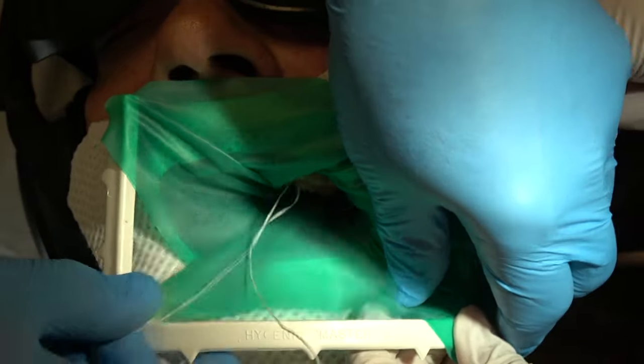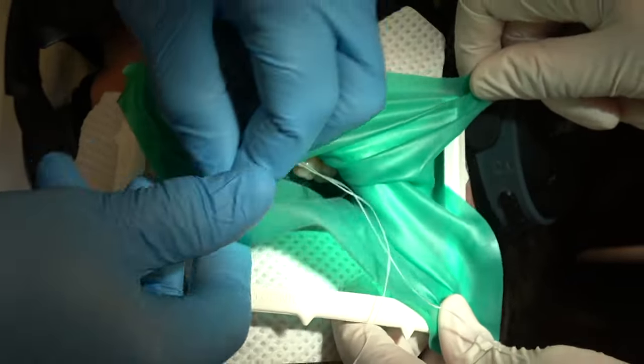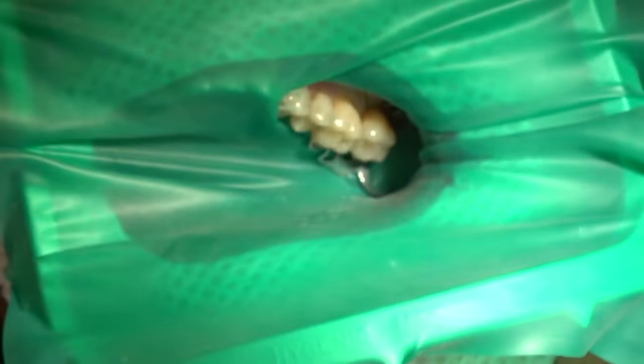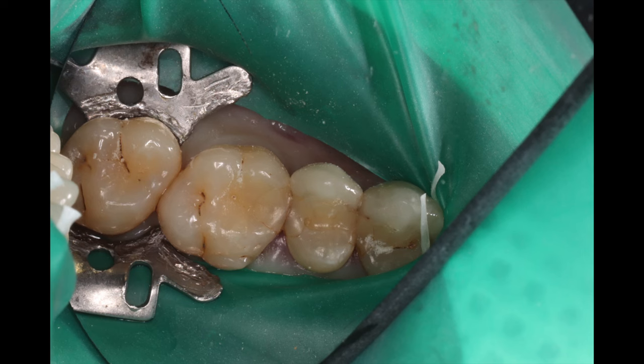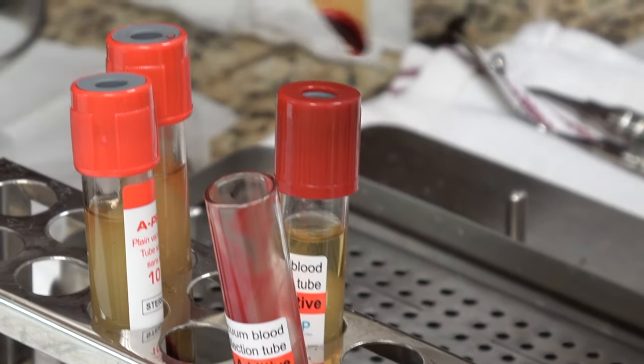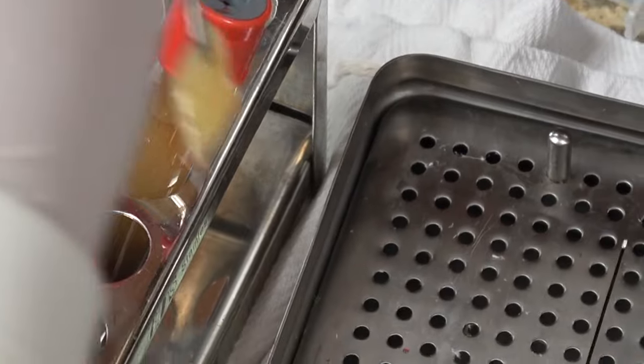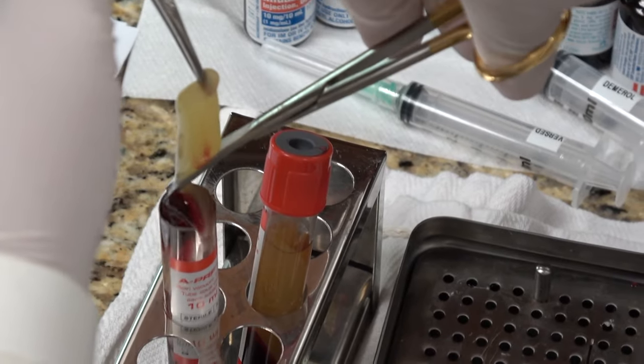I like to use a rubber dam for almost everything. It keeps the patient's tongue out of the way and keeps the water out of their mouth. This is our quick rubber dam technique. And this is the platelet-rich fibrin — see how you're separating the platelet-rich fibrin from the blood clot after it's spun down approximately 16 minutes.